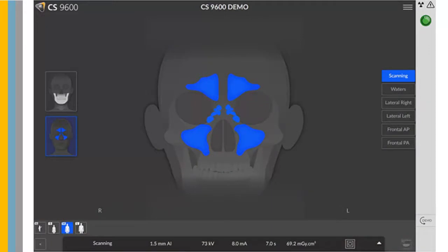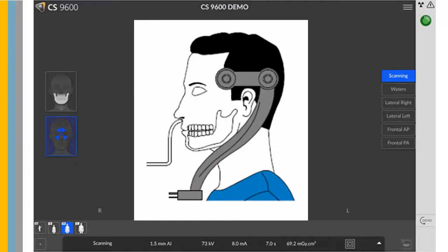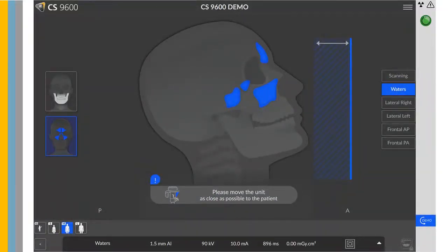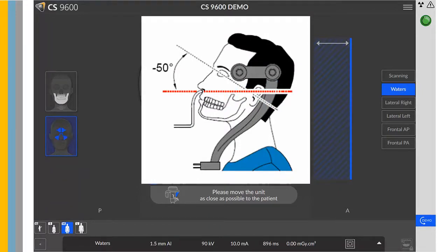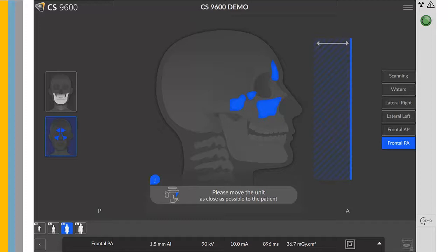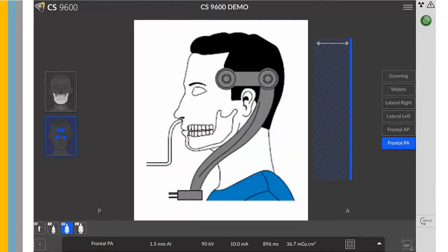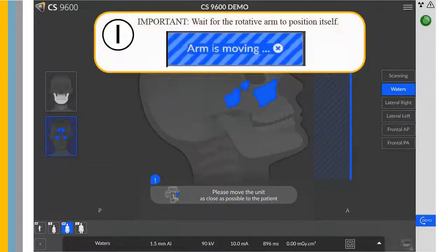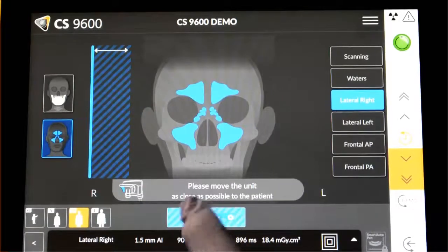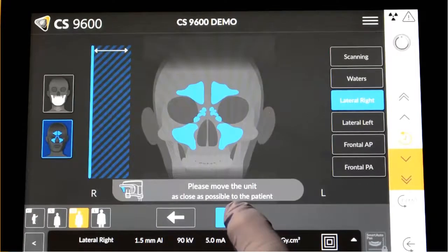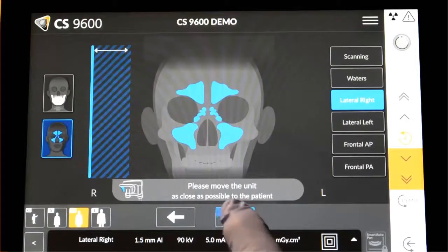To position the patient for a scanning maxillary sinus exam, immobilize the head using the temple support adjusters. For a Water's exam, tilt the head back, then immobilize using the temple support adjusters. For a lateral right, lateral left, or AP and PA area of interest, immobilize the head using the temple support adjusters. Important: wait for the rotative arm to position itself — an 'Arm is moving' message will appear on the control panel. When you see this message, move the unit as close as possible to the patient and use the left and right buttons on the control panel to place the sensor as close as possible to the patient.